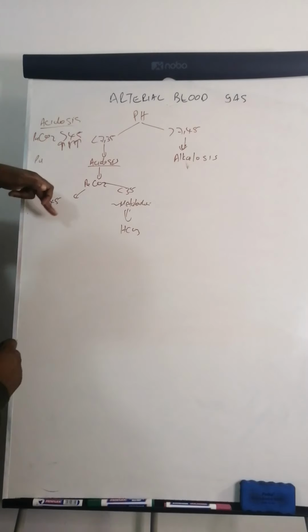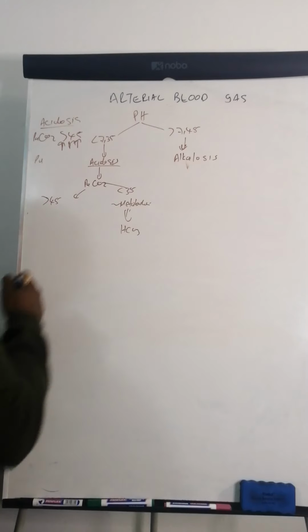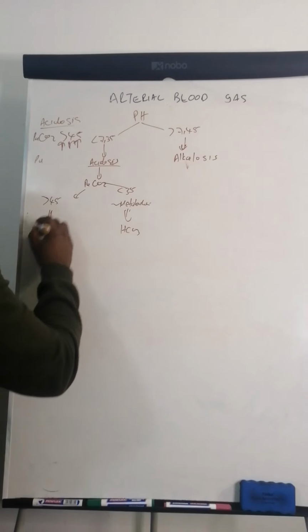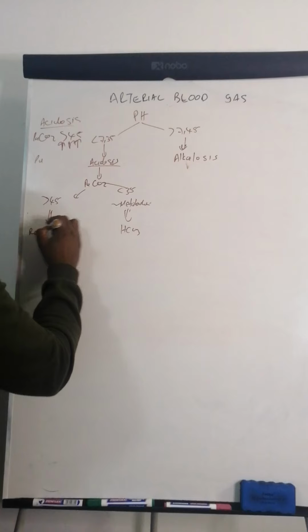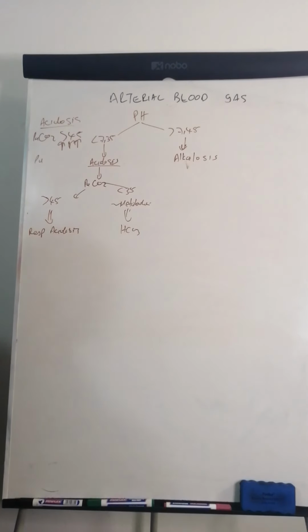But for this patient who's got acidosis and is retaining CO2, we can confidently say that this one has got respiratory acidosis. Okay, let's move on to the other side.